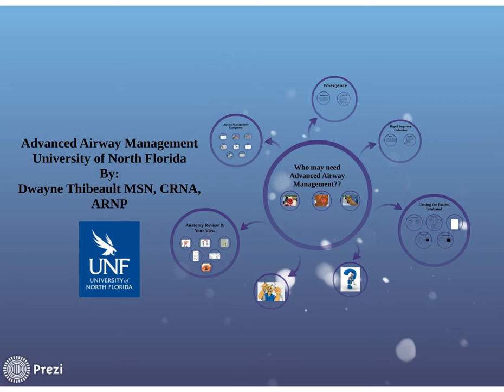How many of you, show of hands, saw a Mallampati 4? Okay, so you know what that means? I'm thinking in my head, what advanced equipment am I going to need to intubate this person? CMAC. I'm already going boom, boom, boom. Which one am I going to use? Now, if I looked at that person, I may not think they're a 4.